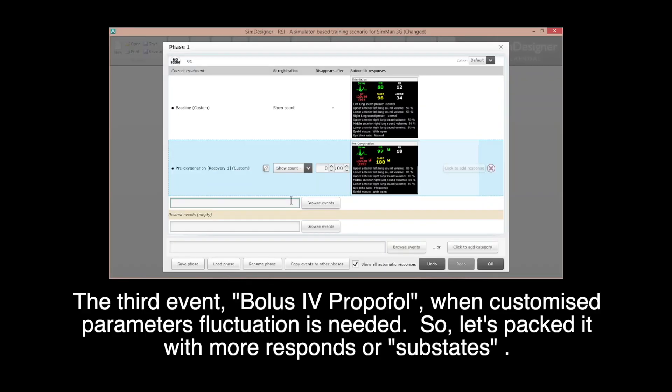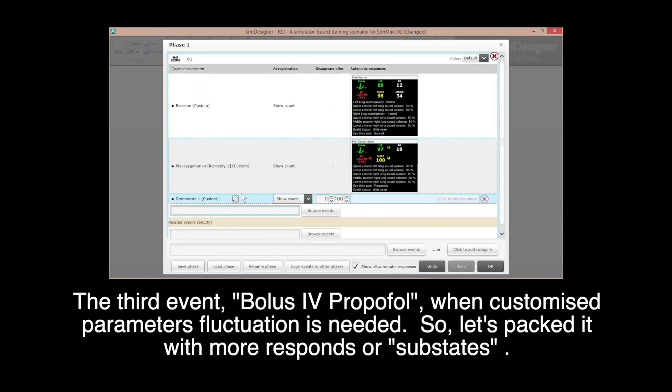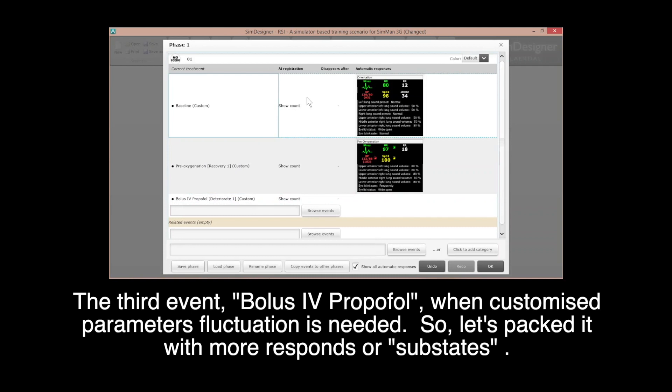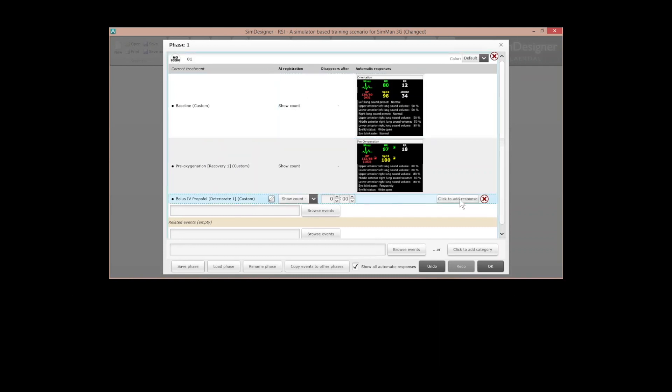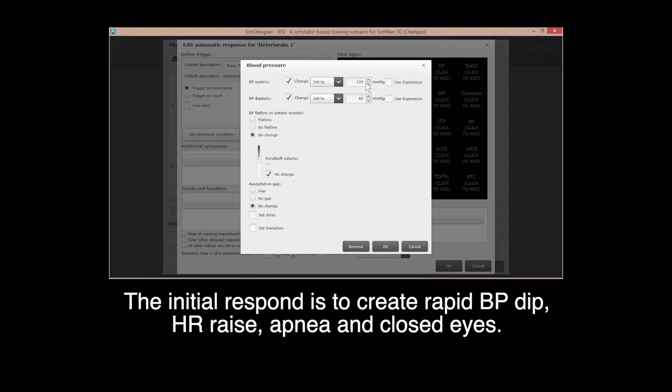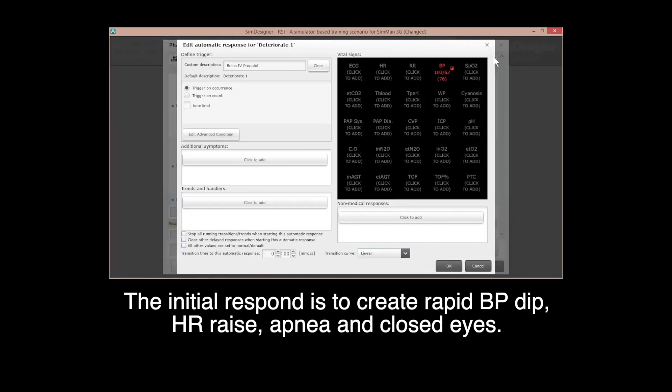Insertion of additional response in event with scenario programming. The third event, bolus IV propofol, when customized parameter fluctuation is needed. So let's pack it with more responses or substates. The initial response is to create rapid blood pressure drop, heart rate rise, apnea and closed eyes.